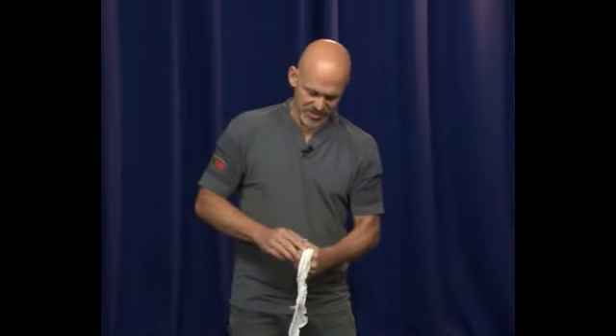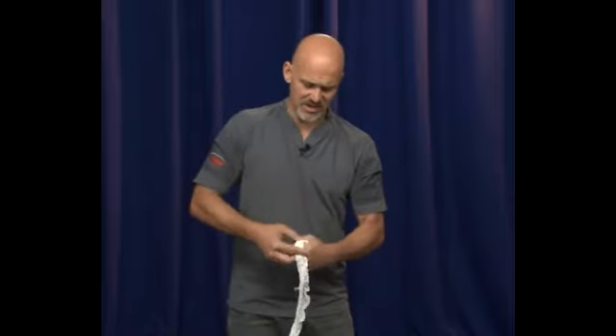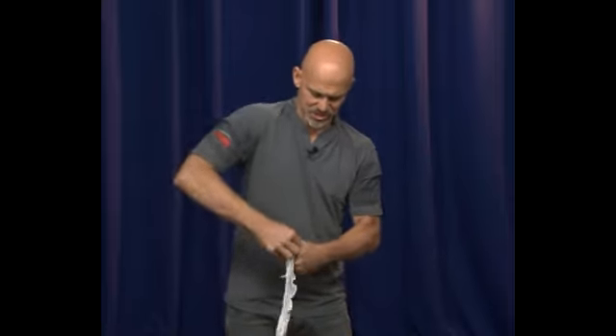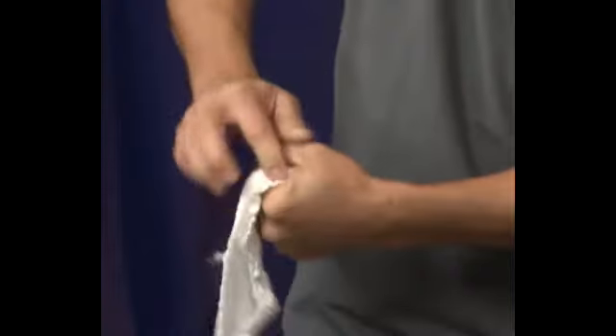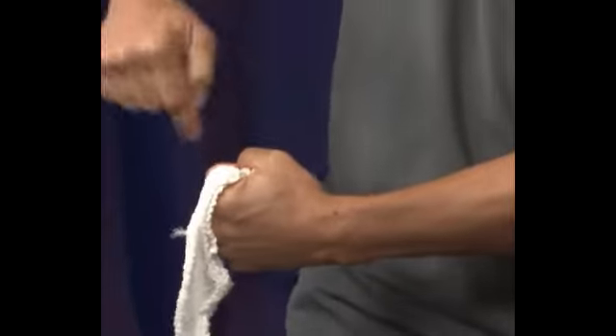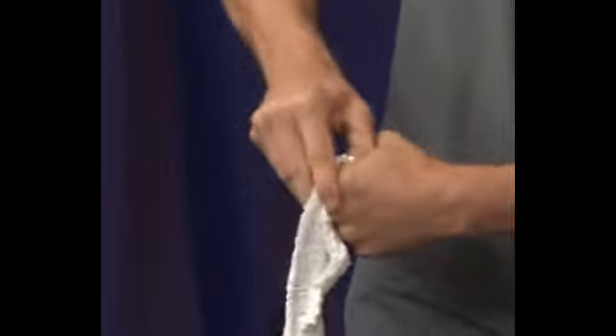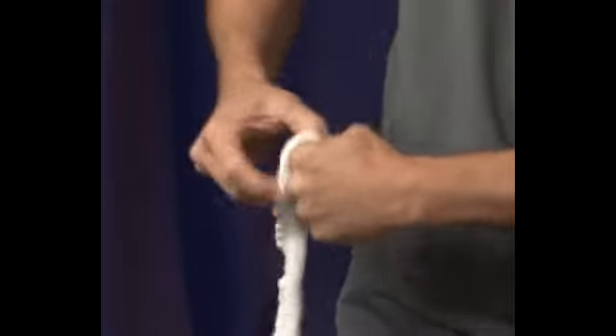You can see I'm exerting some effort here — that's really what we want to do. We want this to be very hard inside of the wound, packing as much material as we can in there. You can see I'm creating space by hitting different angles, pushing in in a star pattern or a circular pattern, maybe opposite and then crossing as I'm packing this wound, packing this material down in.